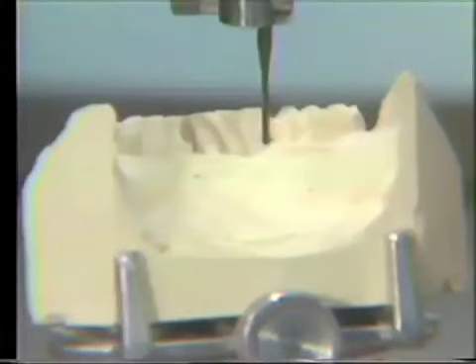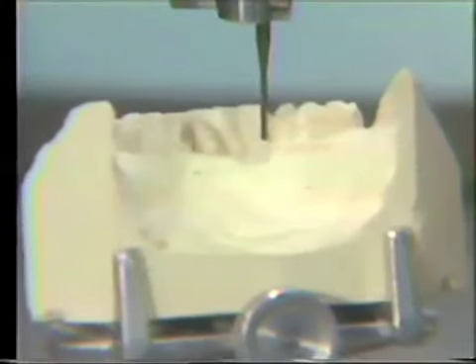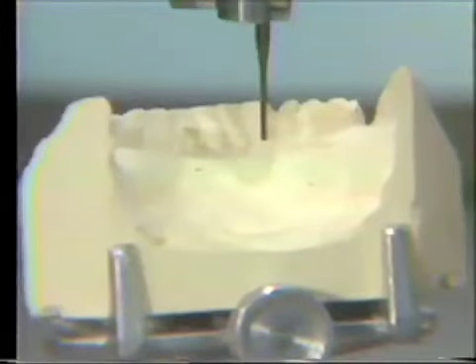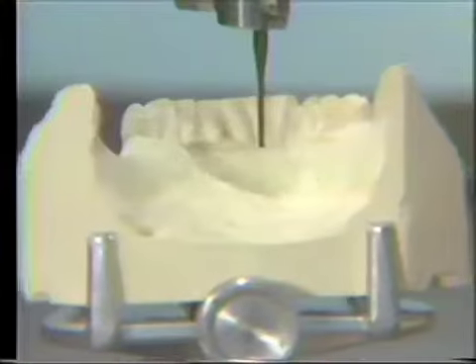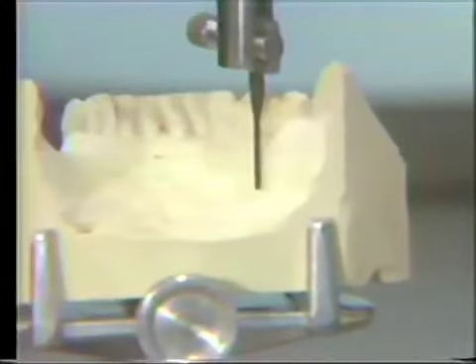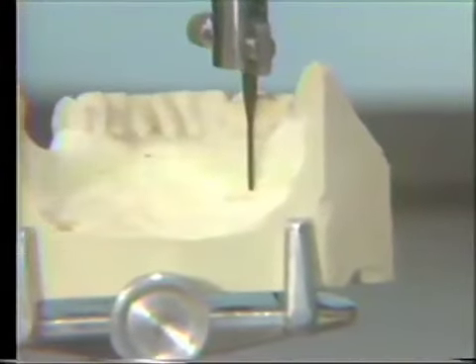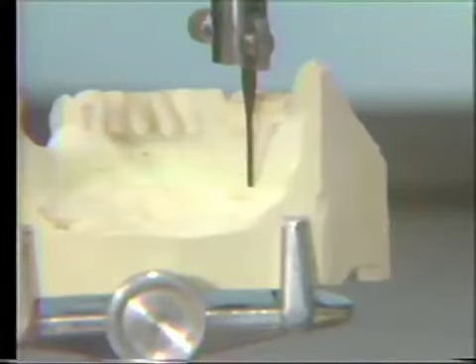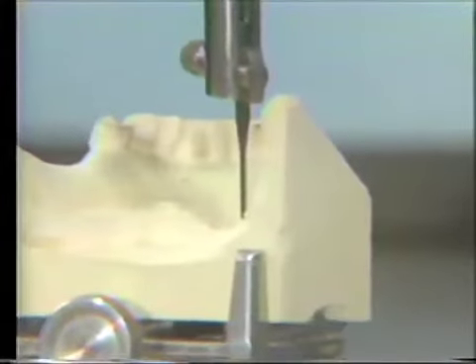Now the other aspects of this cast that we want to check are the soft tissue areas to see if we have any potential undercuts in the soft tissue area. We have satisfied the requirements of the teeth. Now we're going to see if there are any undercuts on the soft tissue or residual ridge areas that would pose a problem.